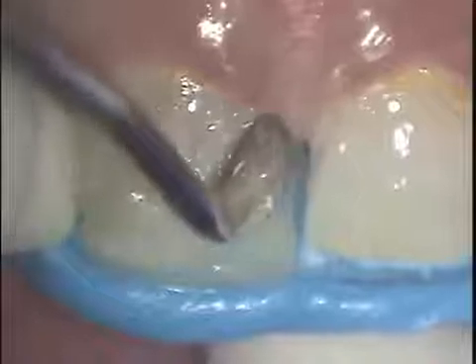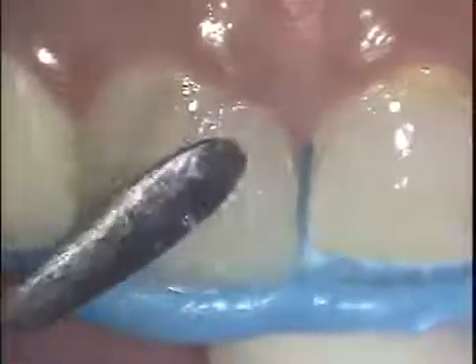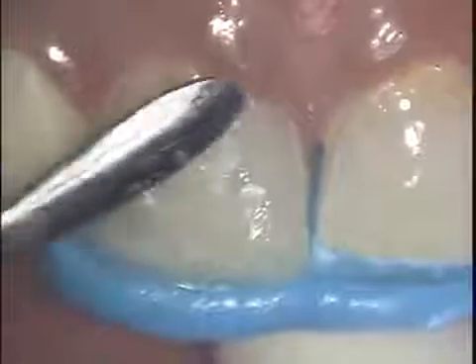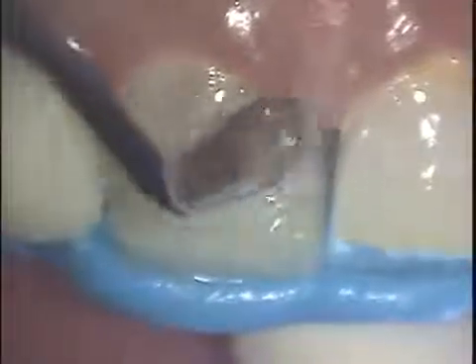Here the composite is blended to the tooth surface using a composite sculpting instrument. It's also very important to make sure that the composite is sculpted into and up against the gingival surface of the tooth to avoid future gingival health problems and to promote excellent gingival health, as well as allowing the patient to maintain good home care.